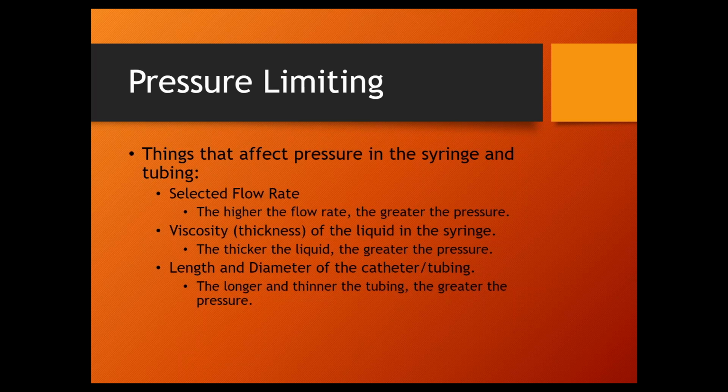It knows if we still have fluid flow, and the way it knows we have fluid flow is if the motor's turning. It may be really high pressure, but if the motor's turning, then we have flow, because liquid can't compress. So if there's an occlusion, the motor can't compress the liquid. If the motor stops turning during an injection, it knows this is an occlusion and stops the injection. But there's nothing really monitoring the pressure in the patient. It just knows that if the motor's turning, we have flow, which means there's basically no pressure from here to the end.